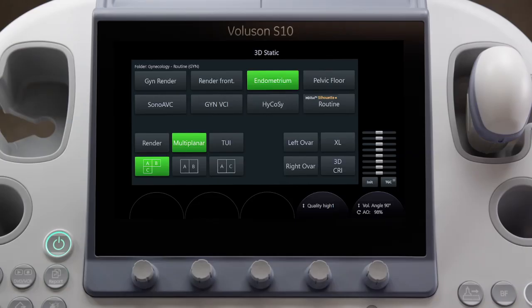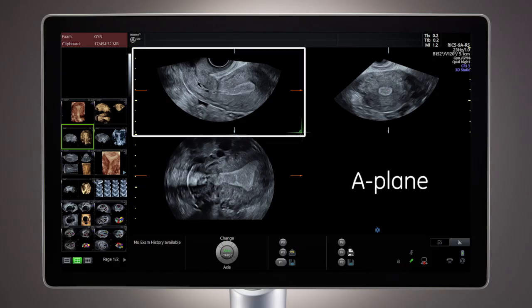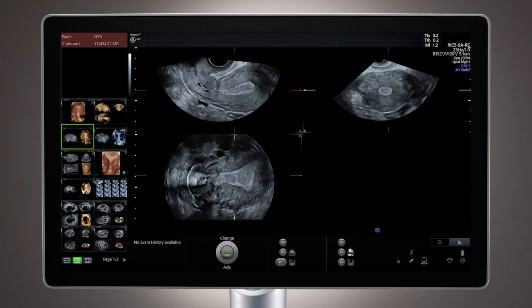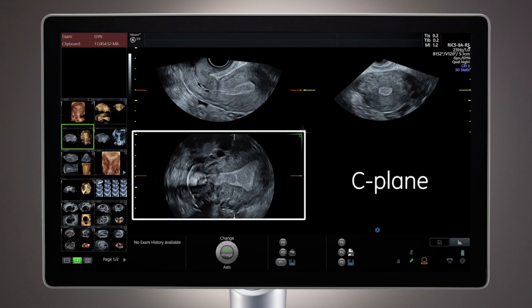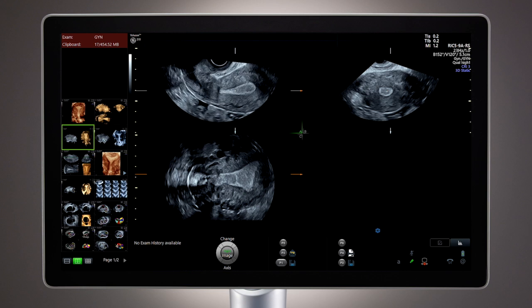To concentrate on the sectional planes, remove the rendered image by selecting Multiplanar from the touch panel. In this quad display, the upper left image is known as the A-plane, the plane of acquisition. The upper right image is known as the B-plane, which is 90 degrees orthogonal cross-section from the A-plane. The lower left image is known as the C-plane, which is 90 degrees orthogonal in the horizontal direction of the A-plane. The parallel shift control knob will pan through each of these planes to evaluate the anatomy in more detail.